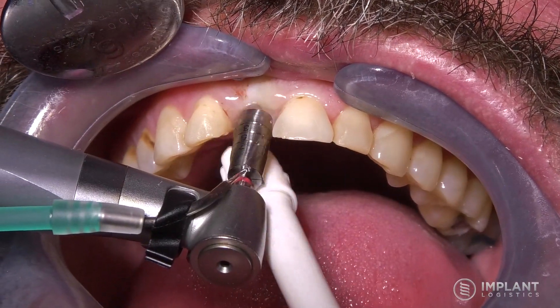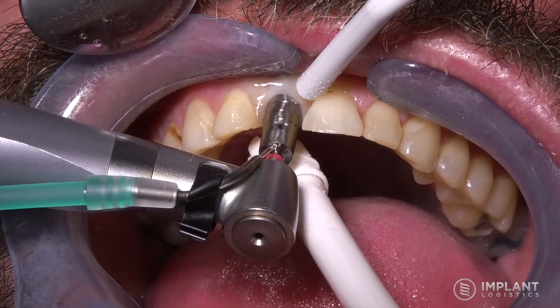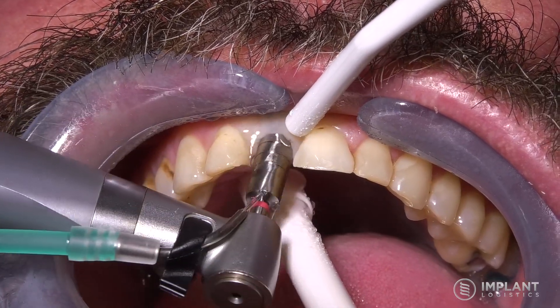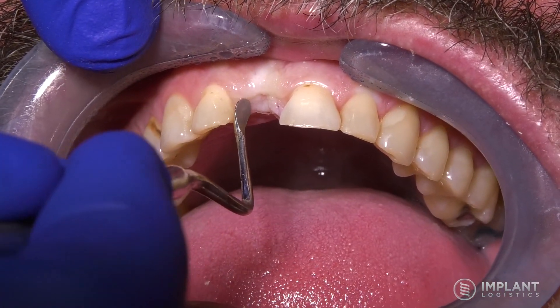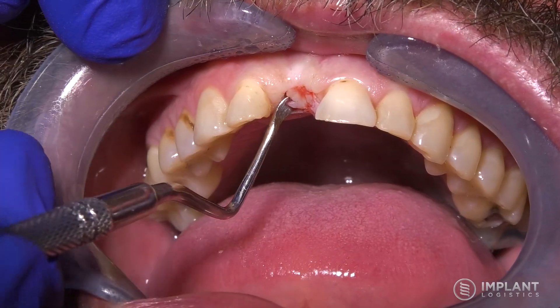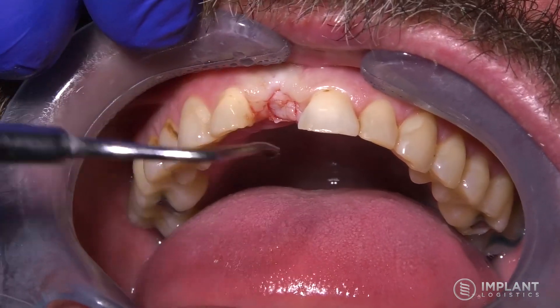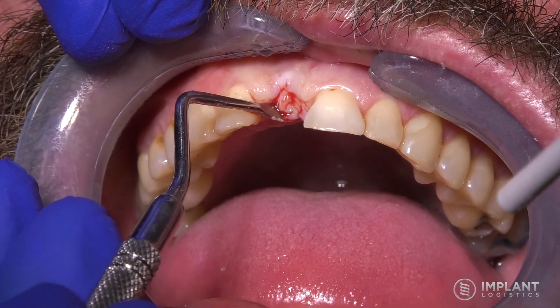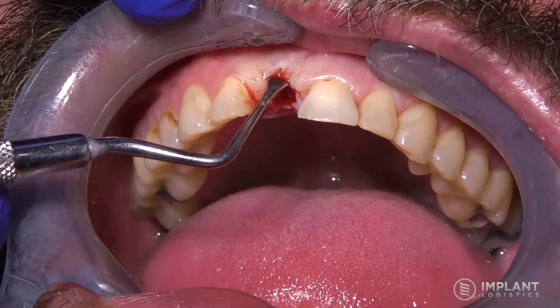To uncover this implant there are several ways to do it. What you're looking at here is a rotating biopsy punch in a motor-driven handpiece. You can certainly do it with a handheld biopsy punch as well. This is probably the most difficult part of the whole procedure — just getting that tissue removed from the site. You can certainly do this with a surgical blade if you find that easier, but generally I use a biopsy punch for a single implant case like this.